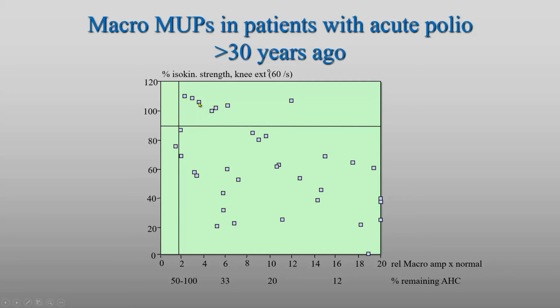And you know, if the average is increased by 4 times, then you may have lost so many motor units that you have only 1/4, 25% left, and still you have a normal strength. It's fantastic, effective reinnervation, and the highest we get is some up to 10 times.